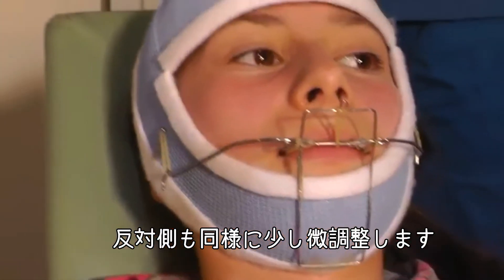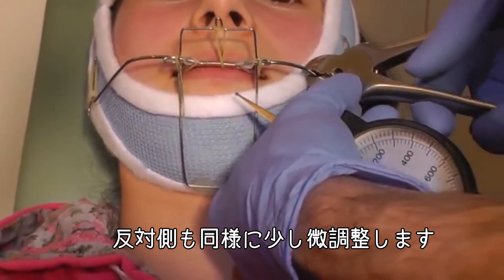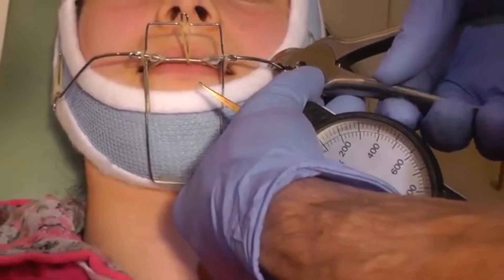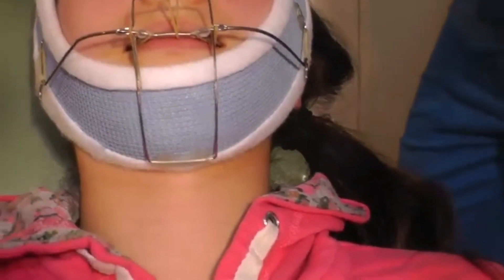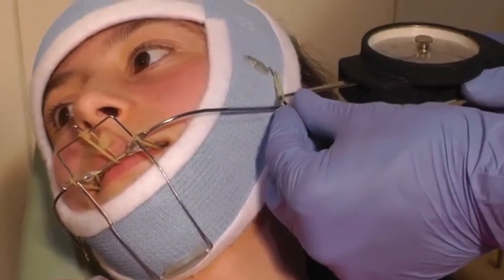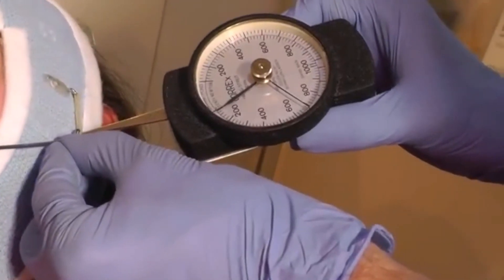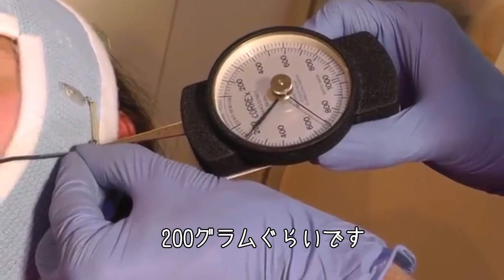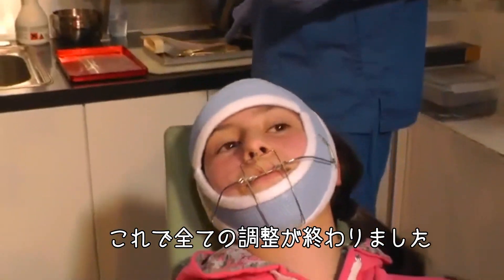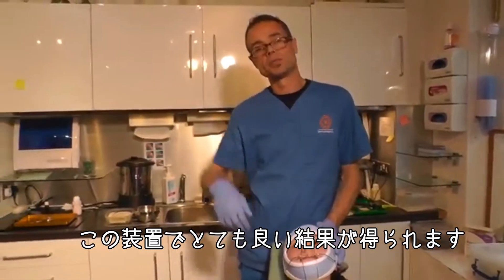I can feel the other one. From roughly the same place, down a little bit — turn your head that way, thank you. And that's about 200 grams. So that's everything in place, and we've had some spectacular results with this appliance.